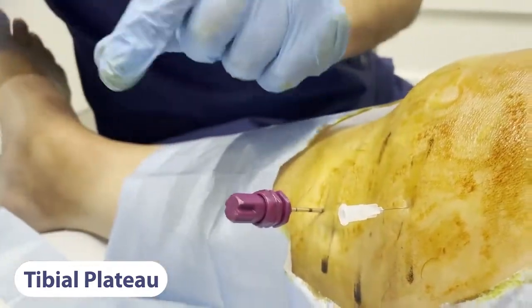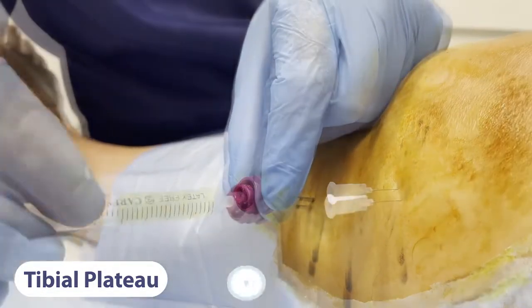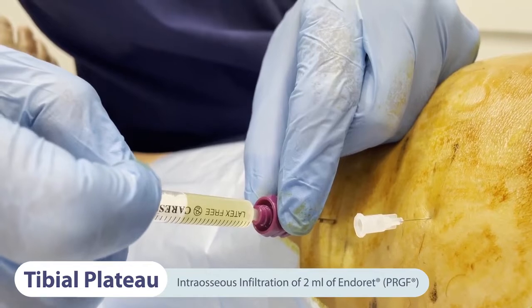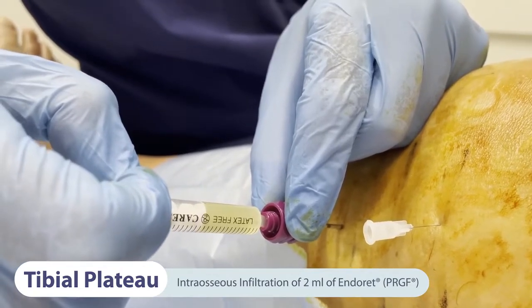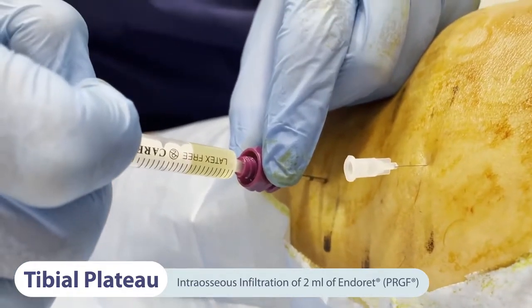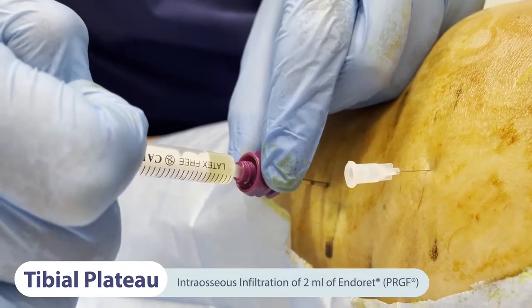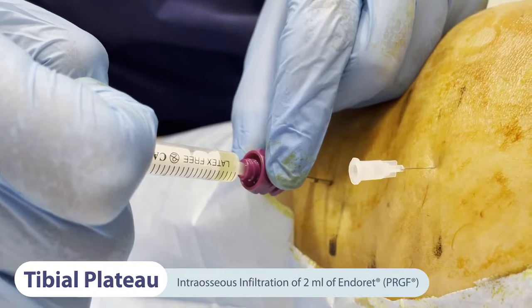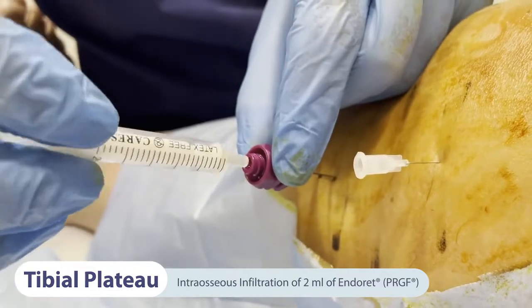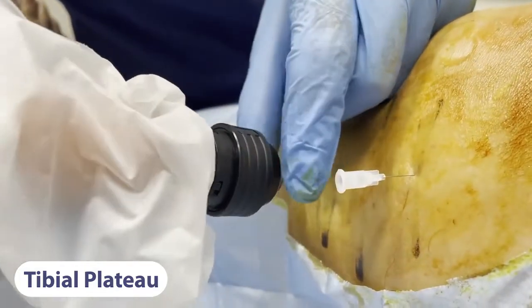Subsequently, the power driver is removed, the needle core pulled out, and 2 millilitres of recently activated PRGF fraction 2 is infiltrated gradually through the trocar. Finally, the needle core is inserted into the trocar, adjusted to the power driver, and the trocar removed.